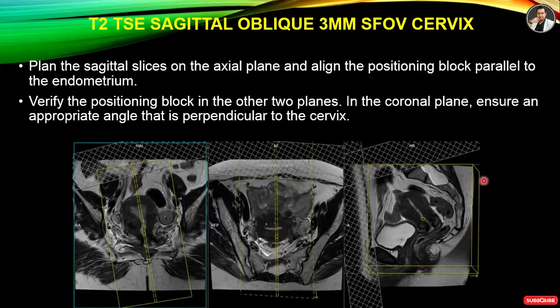We see small details with comfort. We can understand this by seeing it separately. If the field of view was larger, we would not be able to see these details.